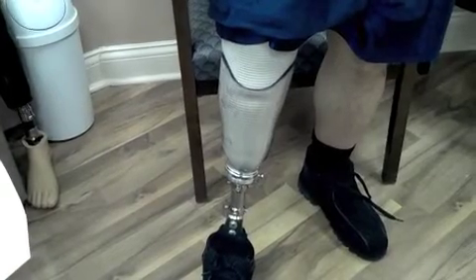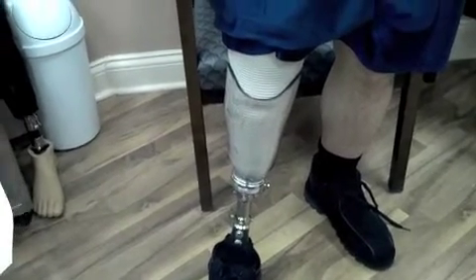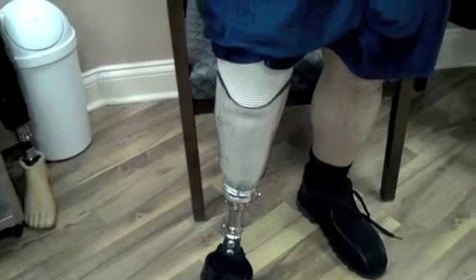If the prosthesis seems to slide on too easy, it is a good indication that you may need to add prosthetic socks.